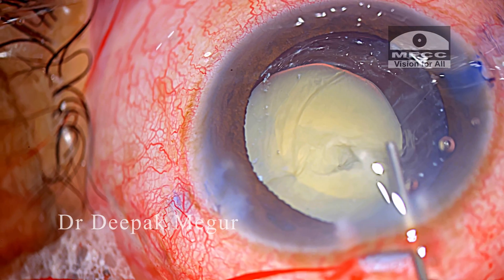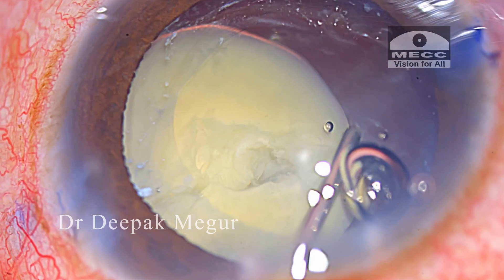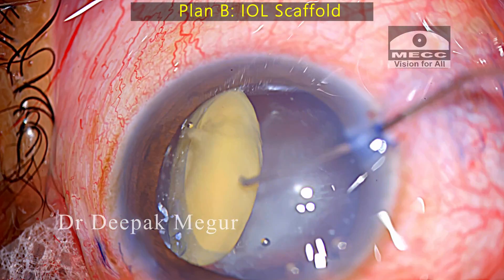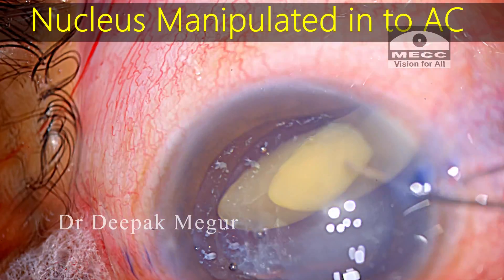It is not looking very safe for me right now. At this point, I decide to change my strategy and go ahead with the IOL scaffold technique, which was described by Dr. Amar Agarwal for emulsifying the nucleus in the presence of a posterior capsule tear.